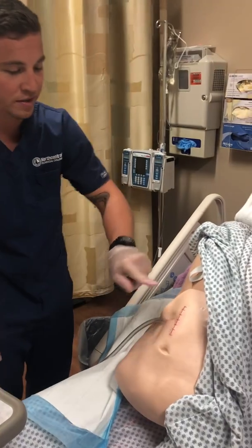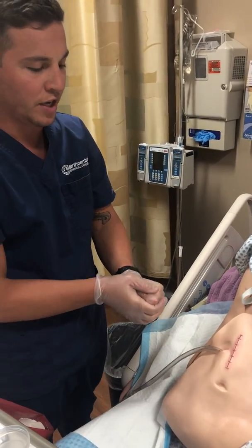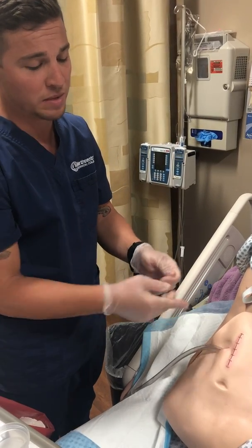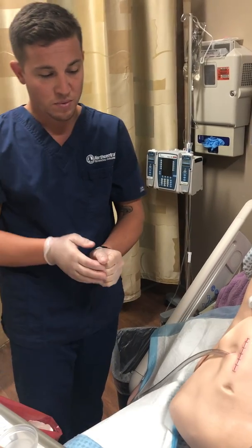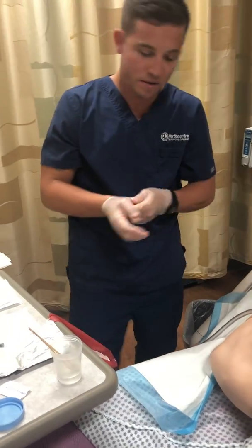And then we're going to look at our site. We're going to assess the insertion site and the skin around it for any redness, edema, ecchymosis, any drainage, and then the approximation, which we're well approximated. So looks good. So next what we're going to do is use a no-touch technique. Here we'll change.